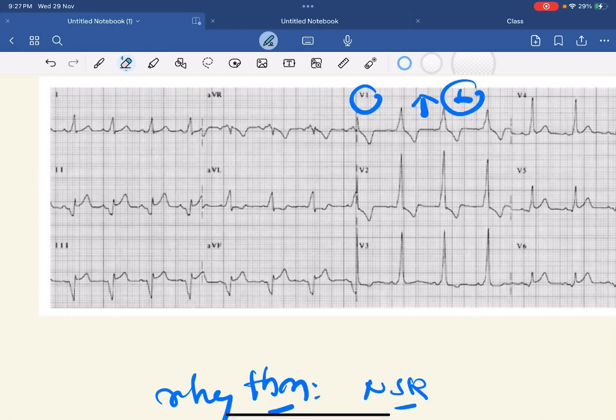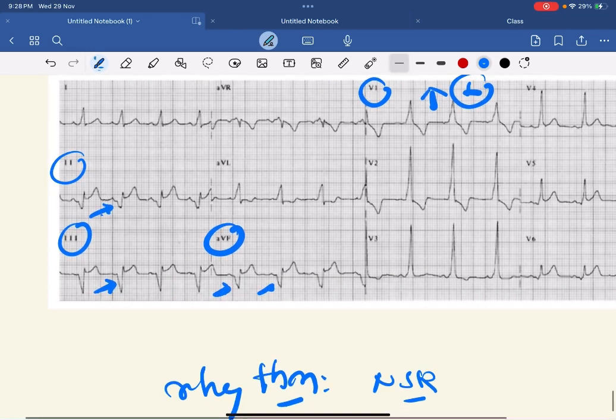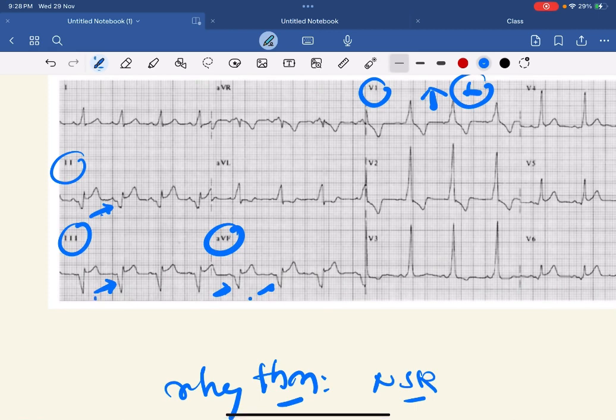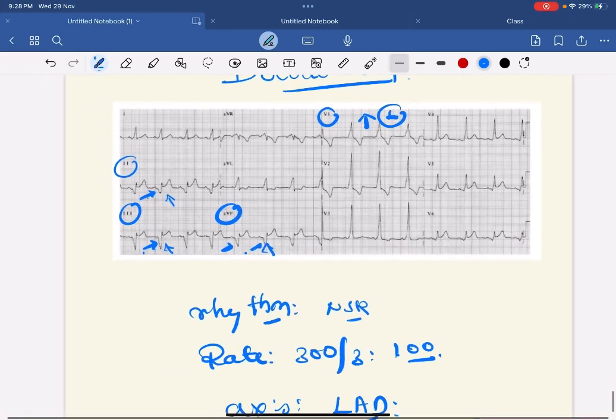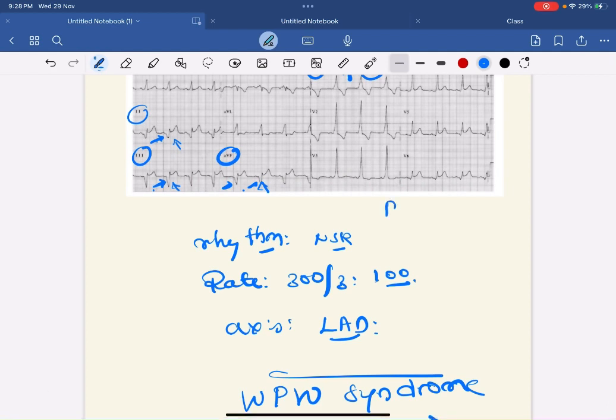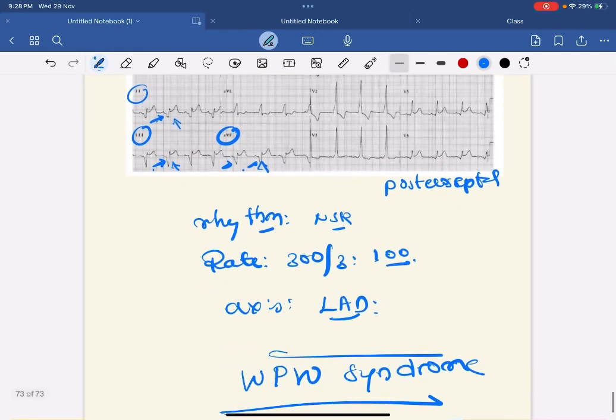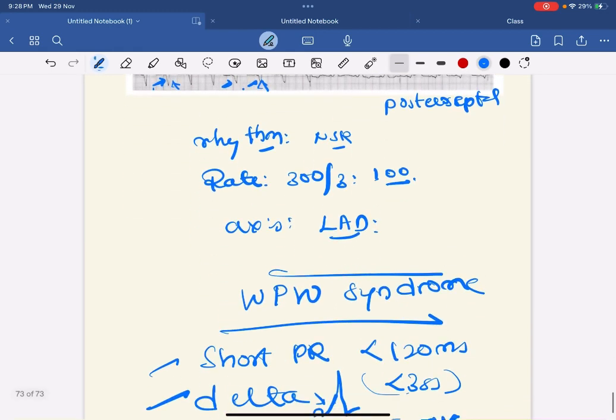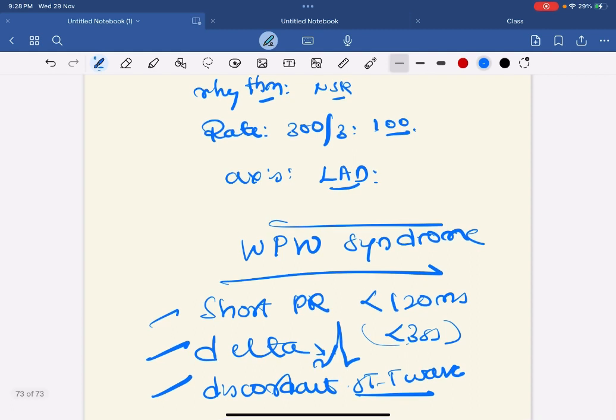For that you have to look at lead II, III, and aVF. See here there are prominent Q waves in lead II, III, aVF. When there are prominent Q waves on the lead II, III, aVF, it suggests posterior septal. So this ECG shows WPW syndrome with left posterior septal bypass tract or accessory pathway.